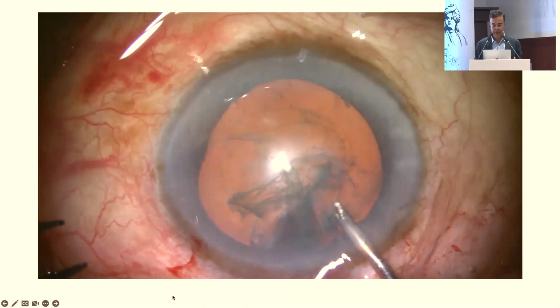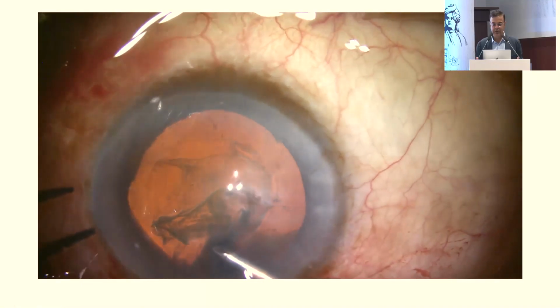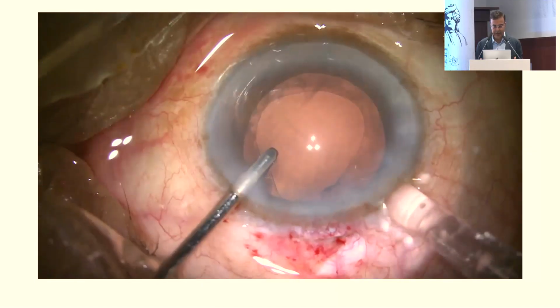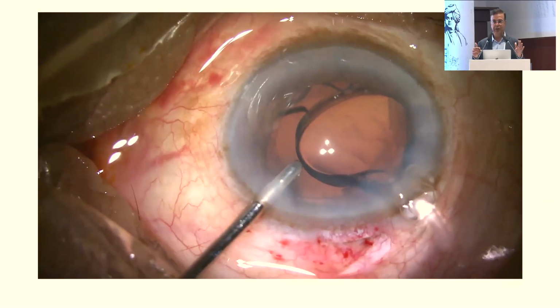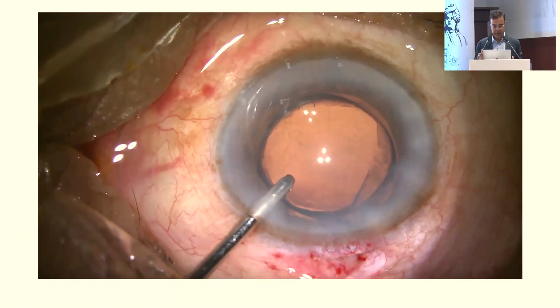So complete that over there. Try to make as much of a rhexis as possible and leave that weak area. Don't do any manipulations over there, and you can see that the flap motility sign is still, as I said, with us. The flaps are twirled up, and the moment it goes to the posterior capsule, they'll just turn inwards and go down. So there you can complete the surgery.